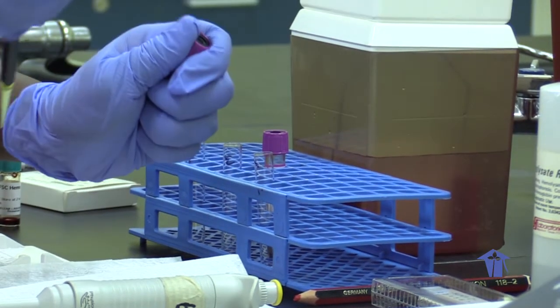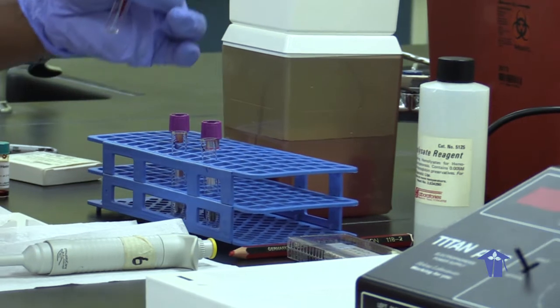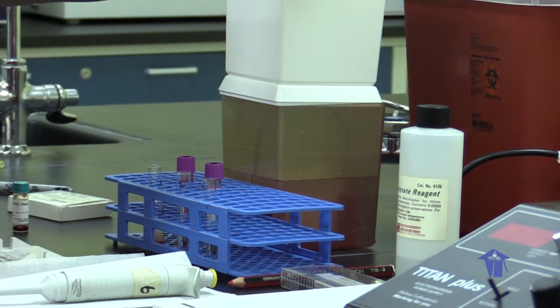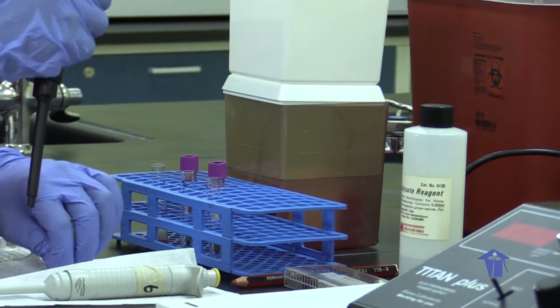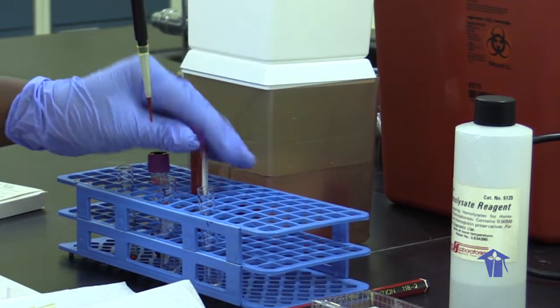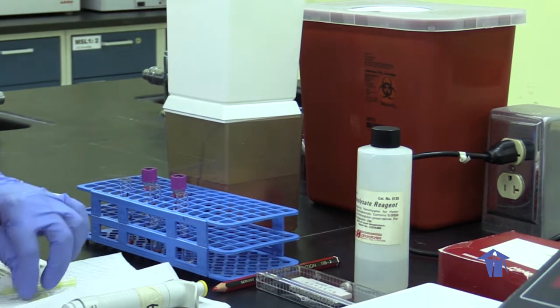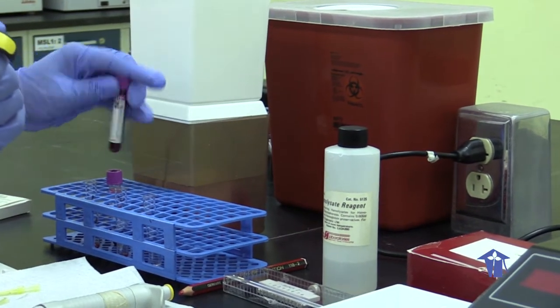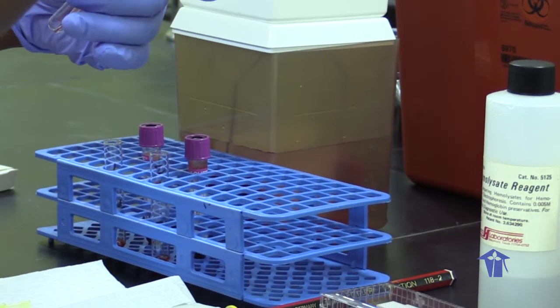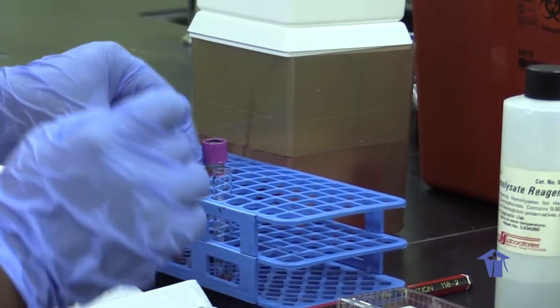A little mix. So now we have our diluted whole blood samples.